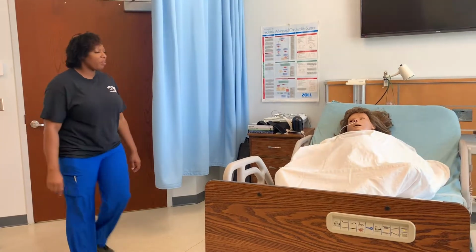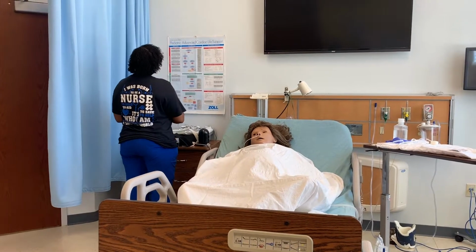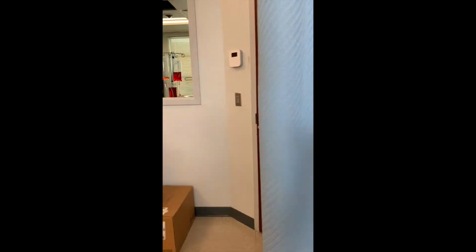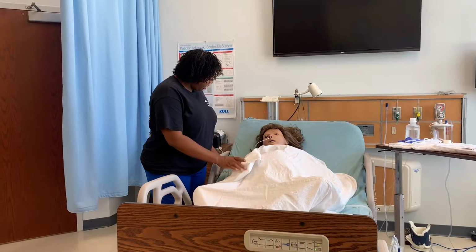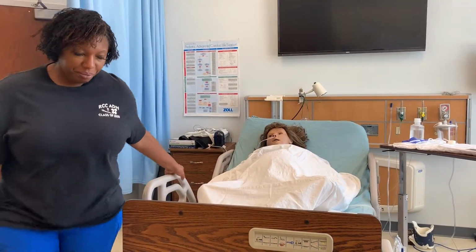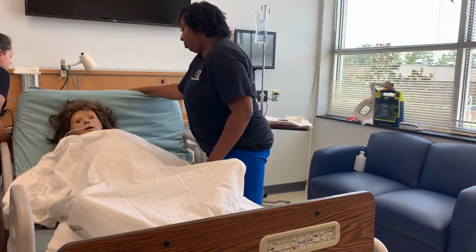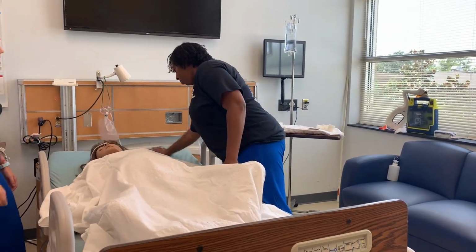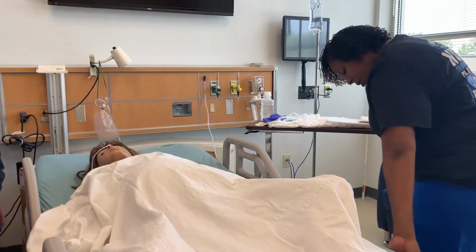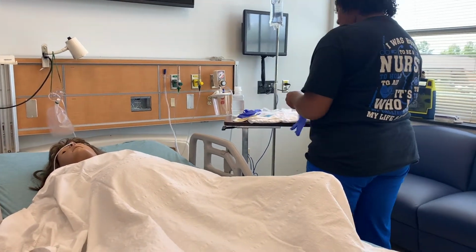Enter the room and introduce yourself to the patient. Perform hand hygiene and identify the patient using the 2 patient identifiers. Assess the patient's pain using a 0 to 10 pain scale. Raise the bed and lower the head of the bed to facilitate an easier working environment. Drop the bed rail on the side on which you intend to work. Then position the patient on their side.